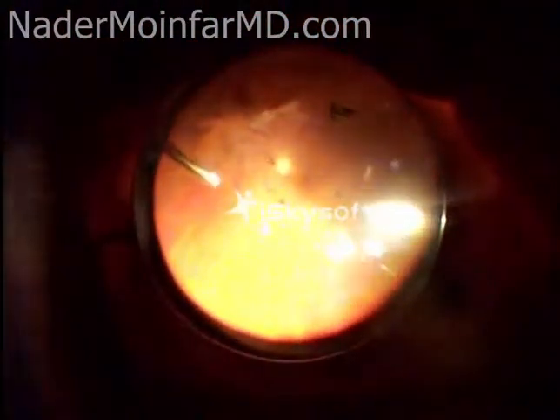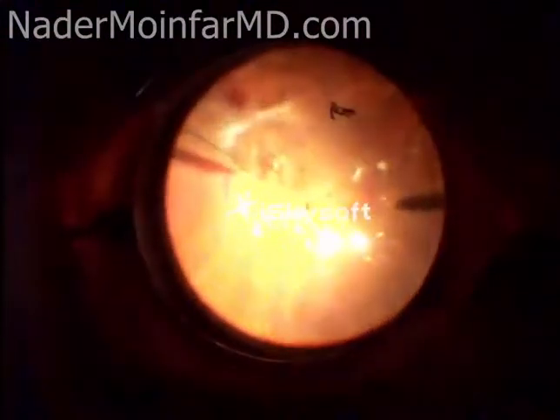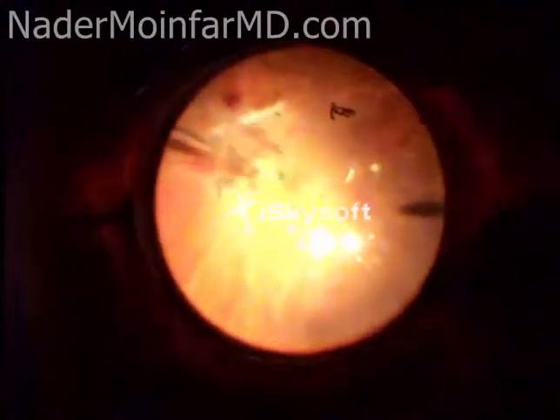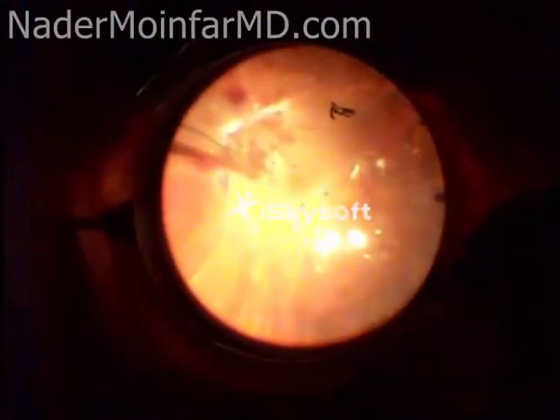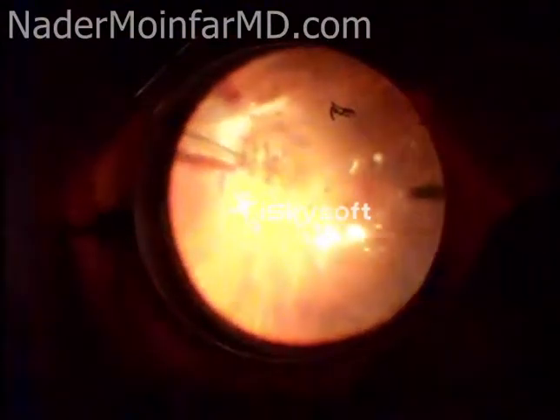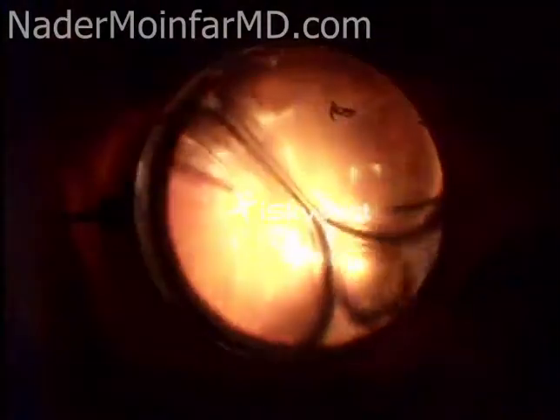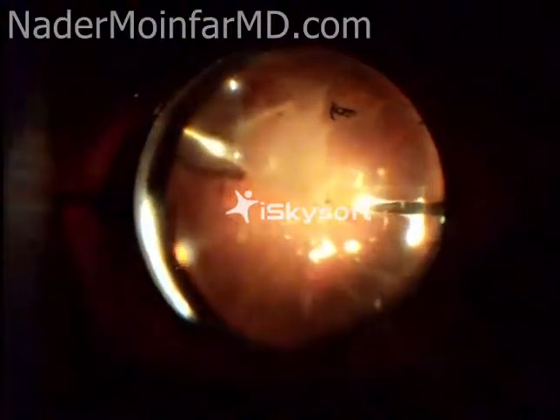Hi, this is Nader Moinfair and this video is of a patient that has a condition referred to as proliferative diabetic retinopathy. The patient has had some blood in the eye called a vitreous hemorrhage which I've already removed, and has a shallow traction retinal detachment which has already been addressed. What I'm doing now is a procedure called an air-fluid exchange.